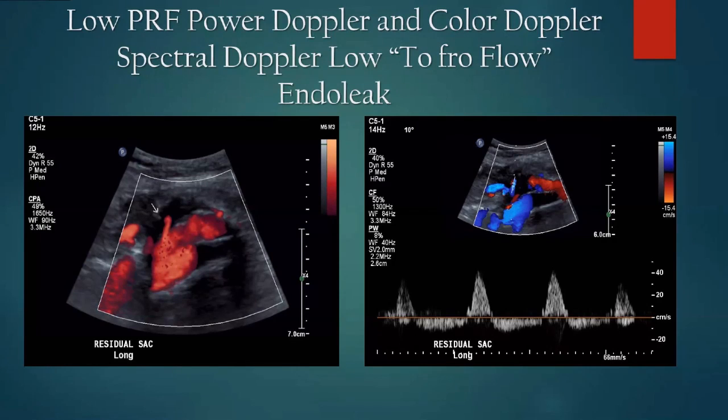So when you use your color power or your power Doppler imaging, sometimes the presets on the machine, when you hit your CPA or your power Doppler, it's all over the place and you're not sure which way to go for optimization, a suggestion is set your PRF to about 2000. That's going to give you a baseline on any study that you do. And then you can go up and down from there, adjusting for optimization. Same with your color.